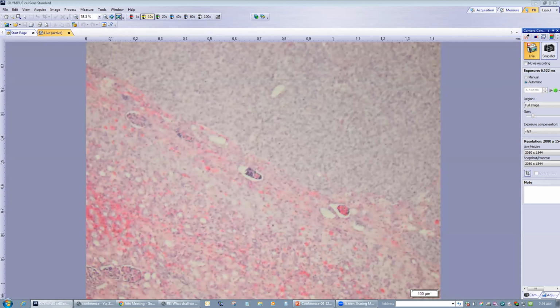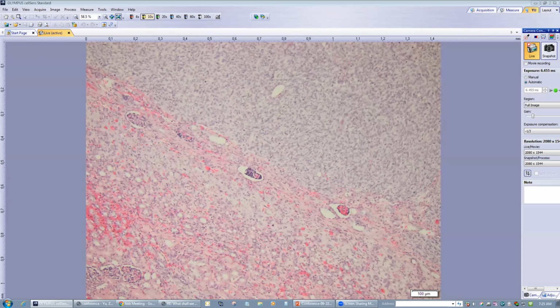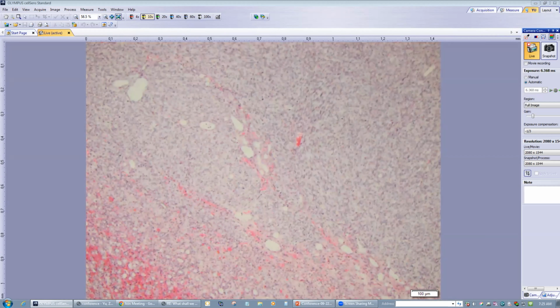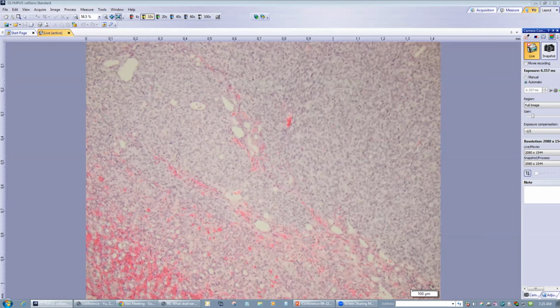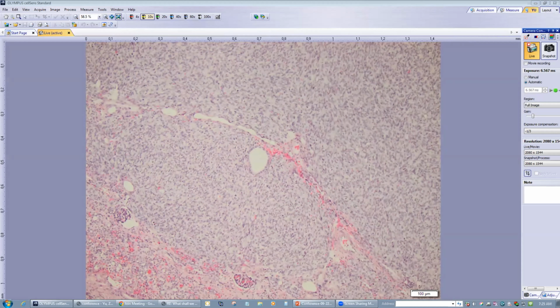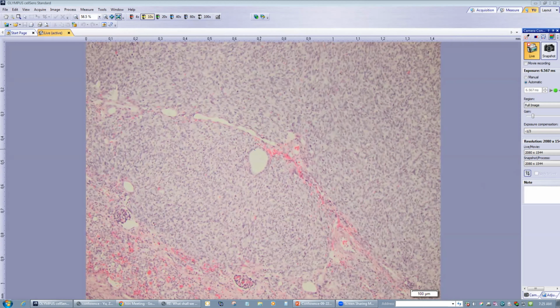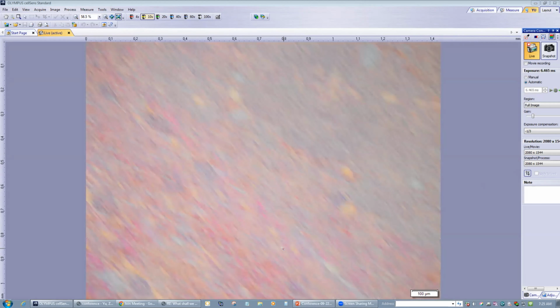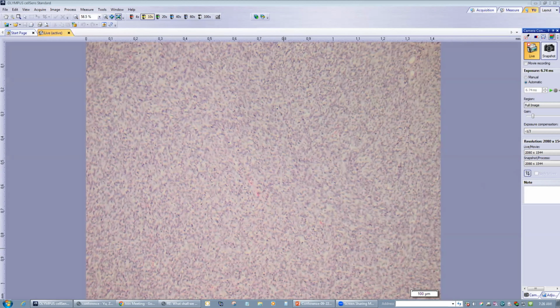So that's a close look at the interface: tumor, normal kidney, and a sharp demarcation. As we go around, maybe a little bit of entrapped tubule like here, but usually not very deep. A few entrapped normal tubules like this. Then we look at the bulk of the tumor.